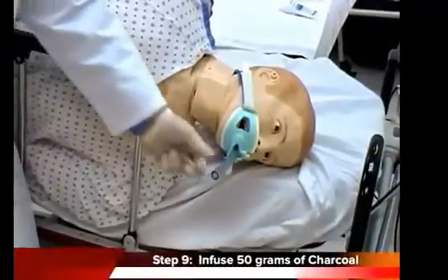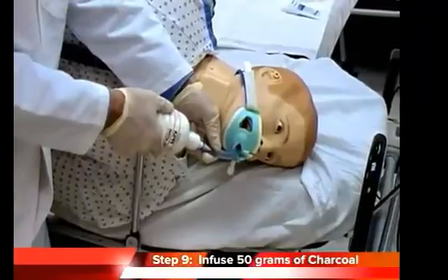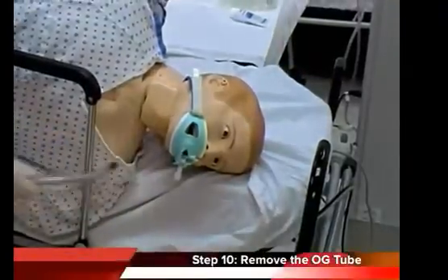Step nine: administer 50 grams of activated charcoal slurry through the OG tube. In children, the dose is 0.5 to 1 gram per kilogram. Step ten: pull the tube back out, and you are done.